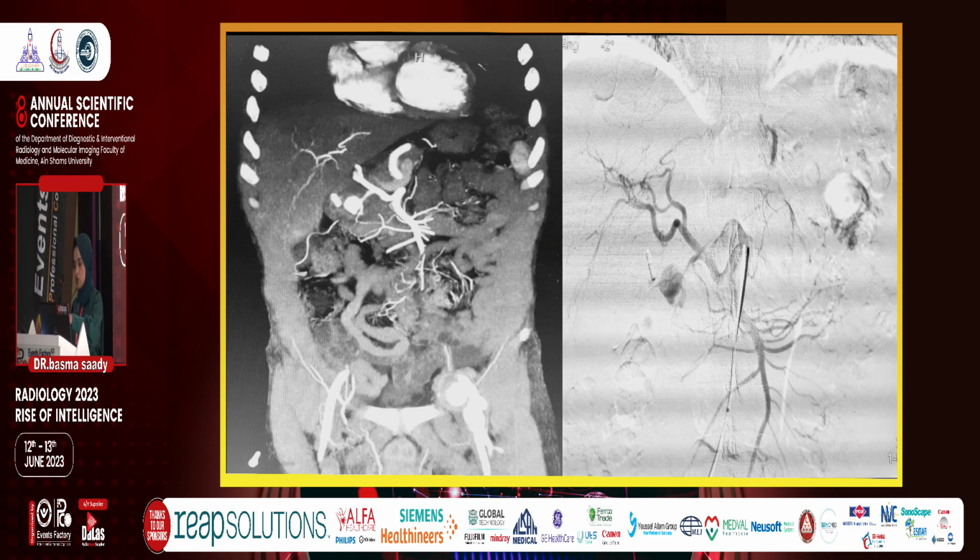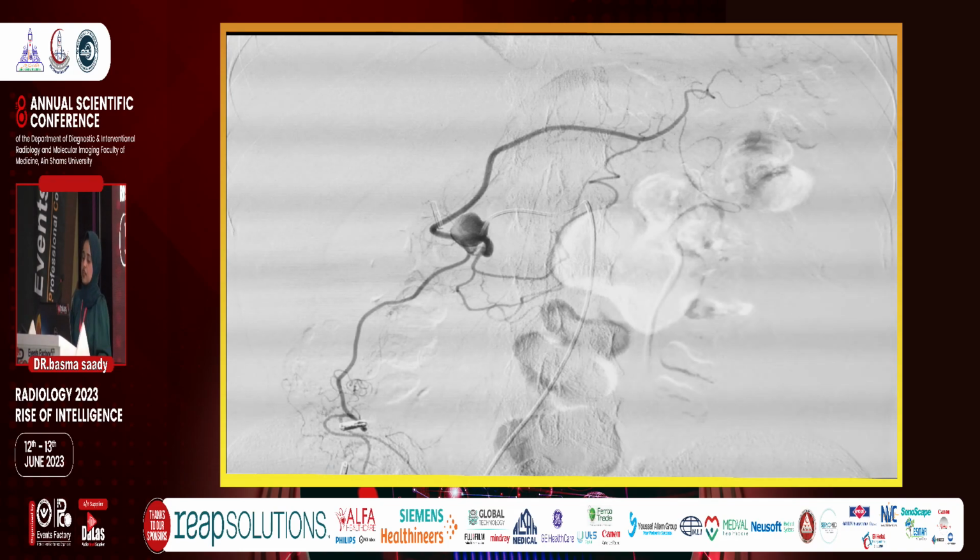And of course, here we can see the clips of the endoscopy. Only 2%, as we've mentioned before. This aneurysmal dilatation receives its blood supply from 2 further arteries. This one, the upper one here, is the right gastroepiploic artery, and then down here, it's the superior pancreaticoduodenal artery.